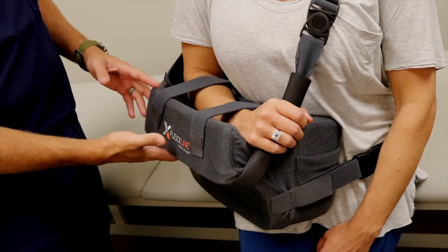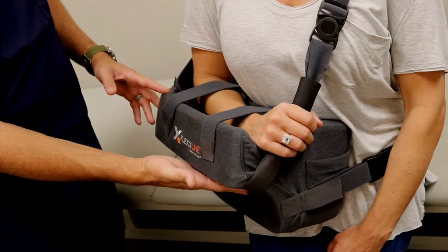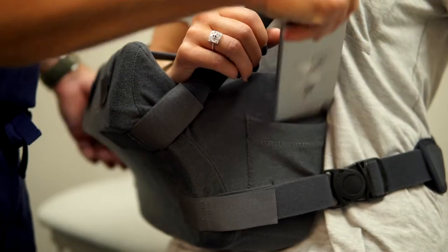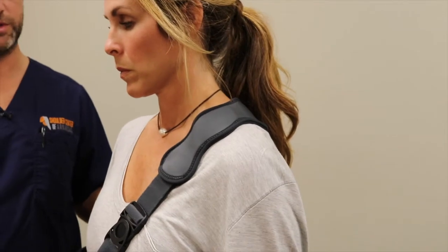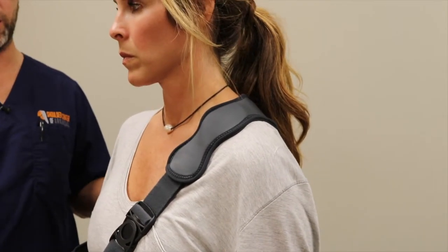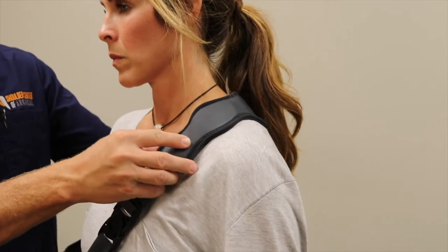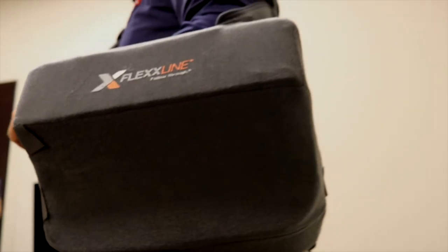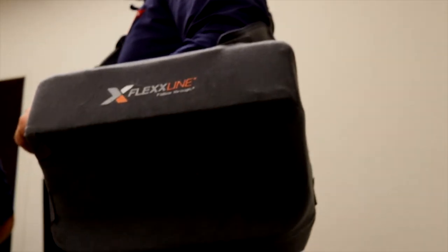The cutout in the primary pillow makes it practical for sitting, and the carrier also provides a cell phone holder. One of the biggest complaints that we see is neck pain, and these scallops really help keep the strap from drifting towards the neck. The overall ease of putting it on and off just gets easier, and once you've done it a time or two the first day or so after surgery, it's really a breeze.